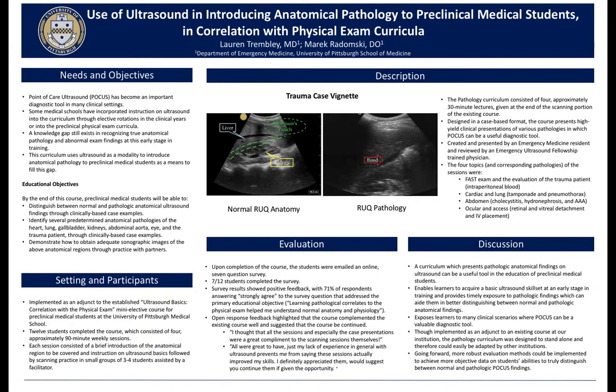Point-of-care ultrasound has become an important diagnostic tool in many clinical settings used by many different specialties. Recognizing the greater role that ultrasound is playing in clinical practice, medical schools have started to incorporate instruction on ultrasound into their curriculum. Sometimes this has taken the form of an elective rotation for the students in their clinical years, and then other schools have implemented ultrasound instruction earlier, introducing it into the physical exam curriculum in the preclinical years.